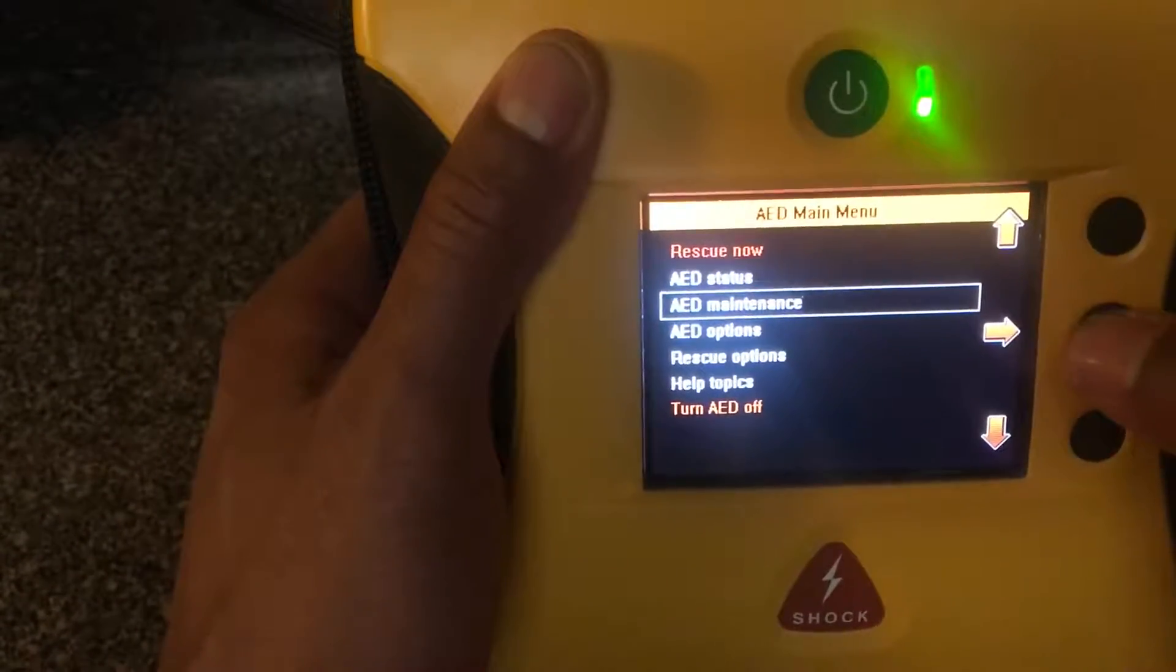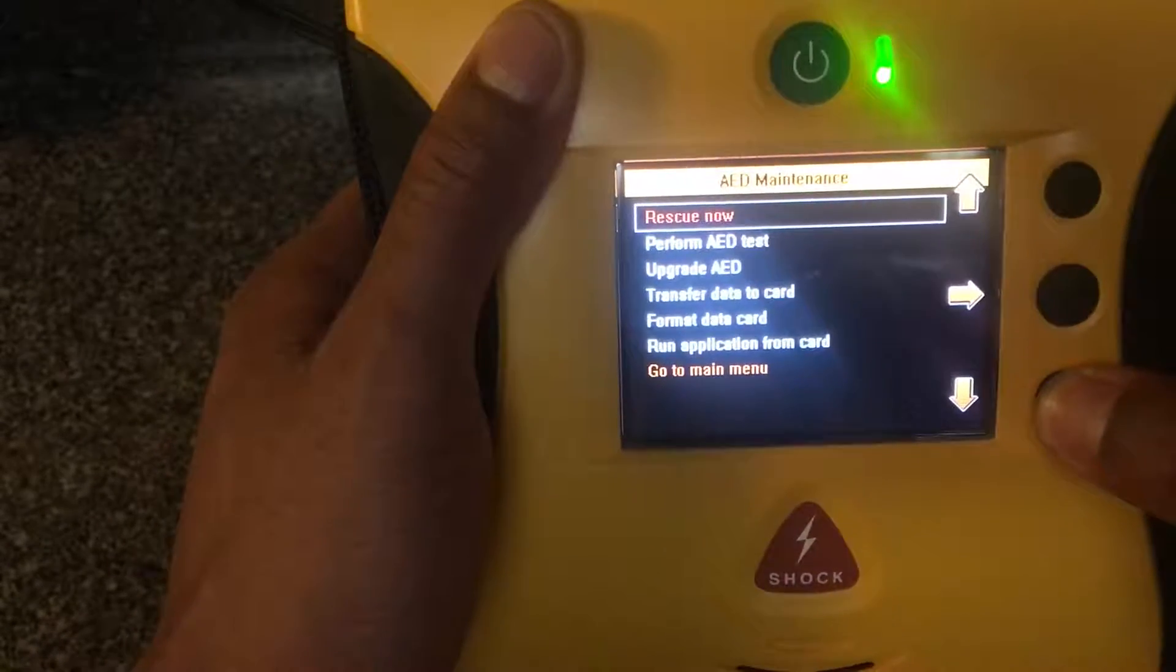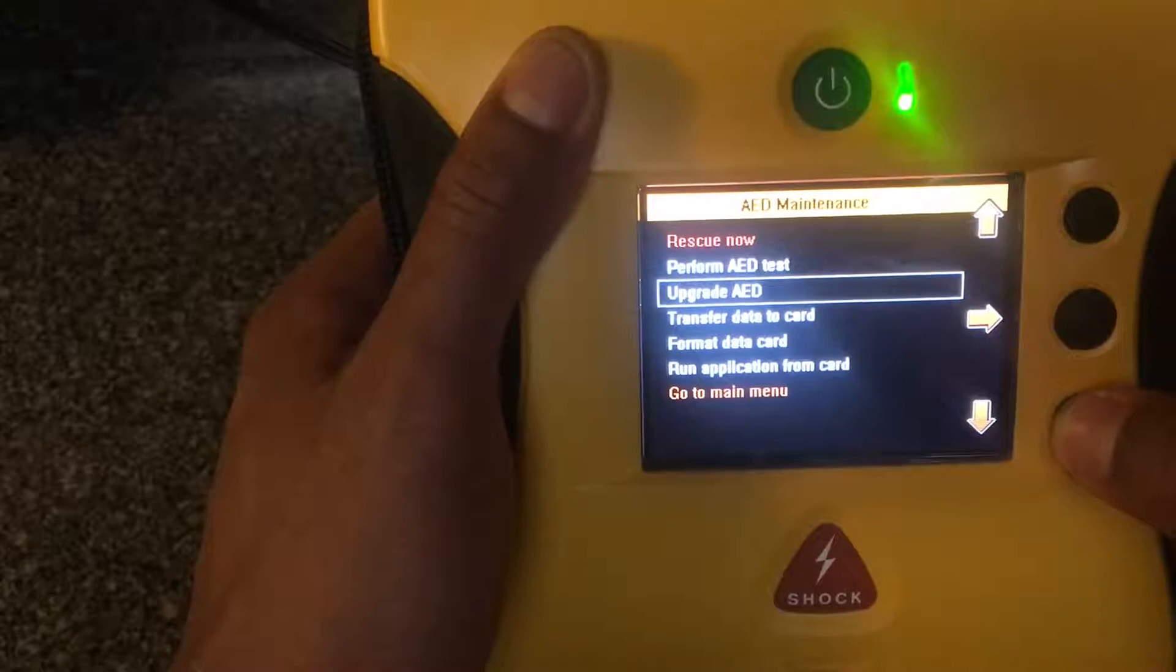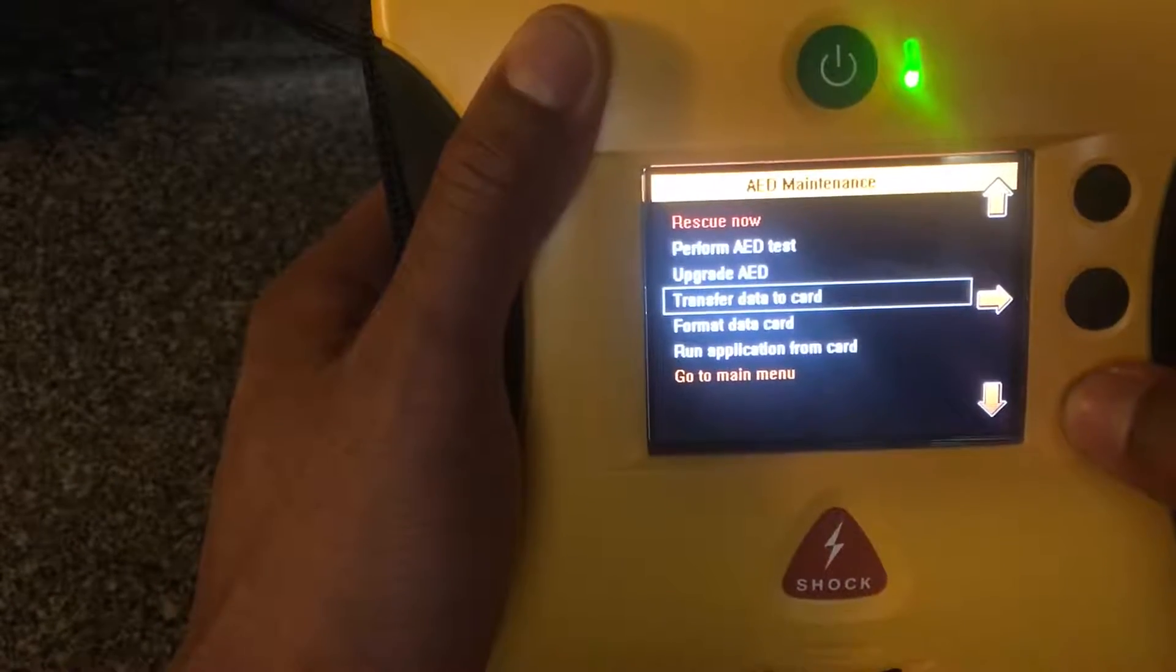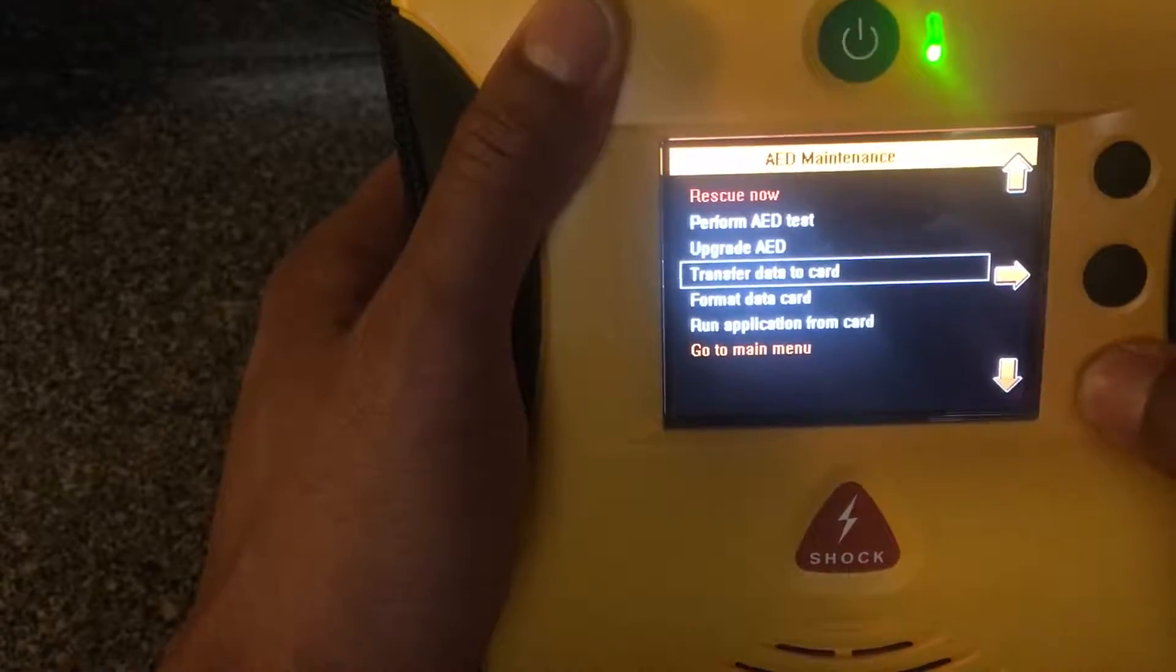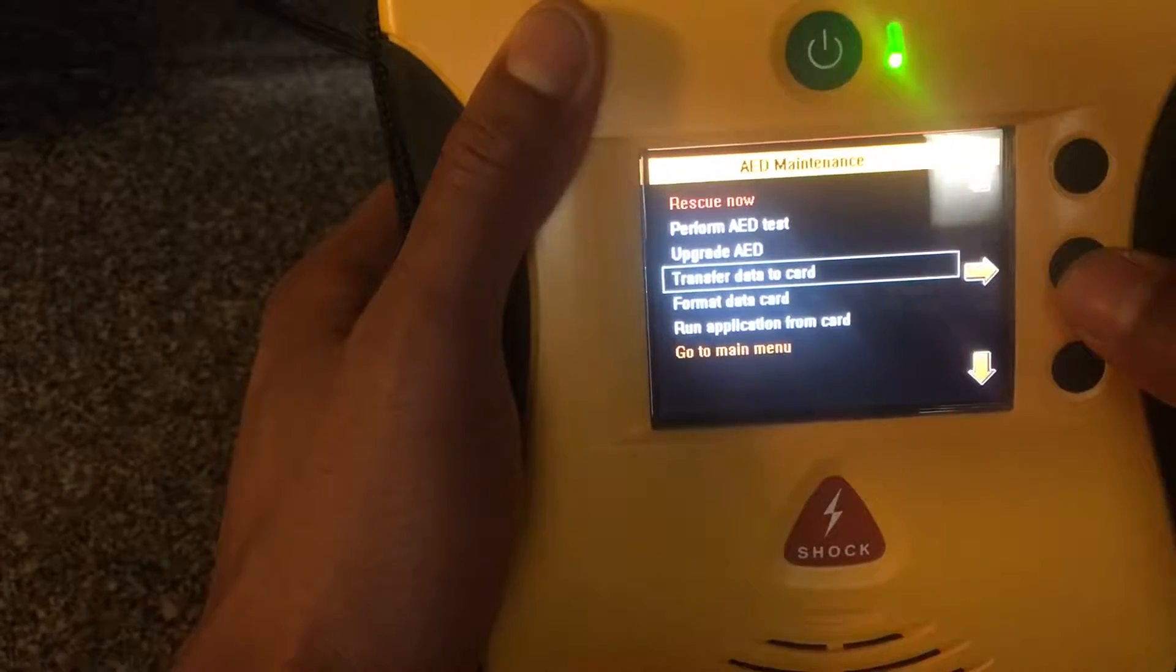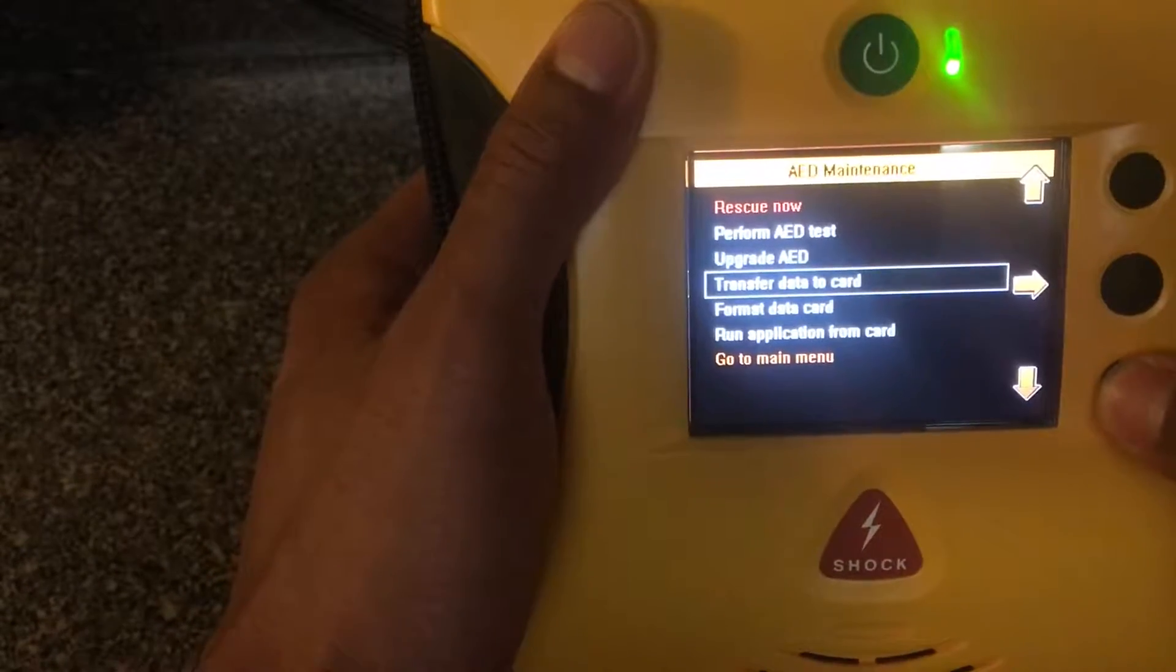It gives you all sorts of things that you can do: perform an AED test, upgrade an AED, transfer data to a card, which you need to do after you have an incident or something's wrong with the defibrillator.